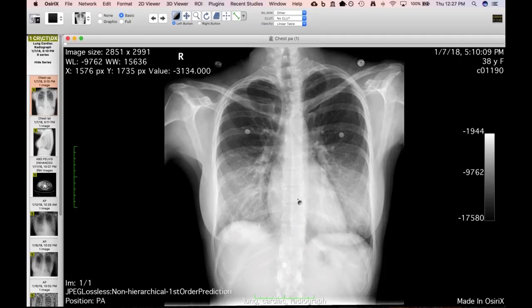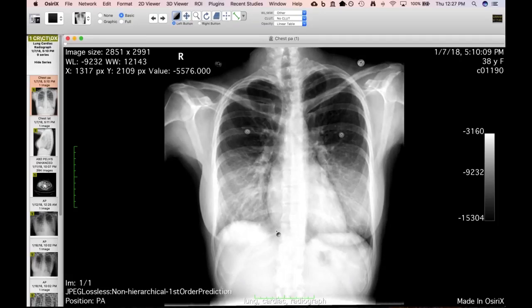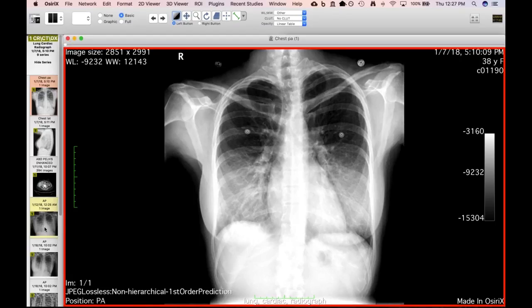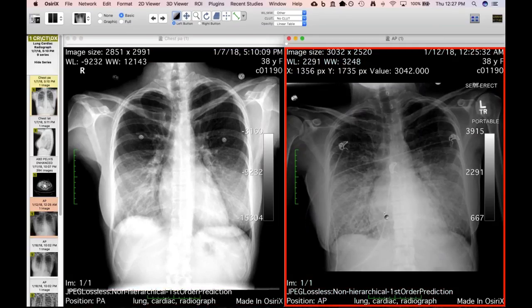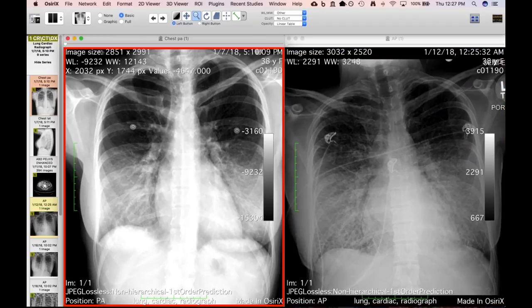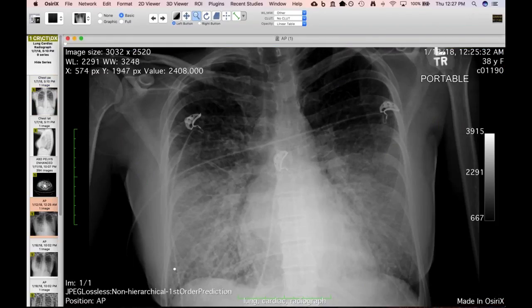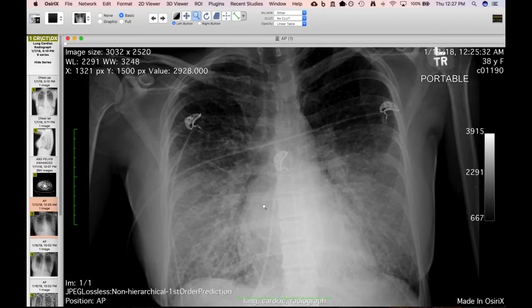They admitted her around the time of this radiograph, which was not too bad initially. But five days later, she is in florid edema — beautiful septal thickening, Kerley B lines peripherally, fissural thickening, cuffing, a little distention of the azygous. Her left atrium appears enlarged.